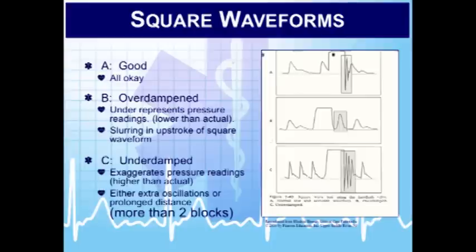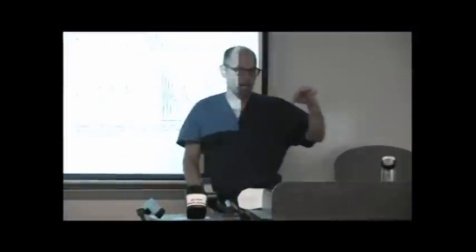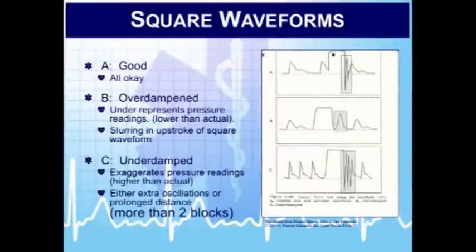So this is showing you an arterial pressure waveform from an arterial line. And what this is here is me pulling the pigtail or squeezing the little valve on the transducer and introducing rapid flush through that line. That's the change on the waveform that I see. So I pull the little pigtail on the example of the transducer that I have there. The waveform squares off, and when I let go of the pigtail, the waveform bounces very sharply and then goes back to the arterial waveform. That's a good square waveform test. Right?